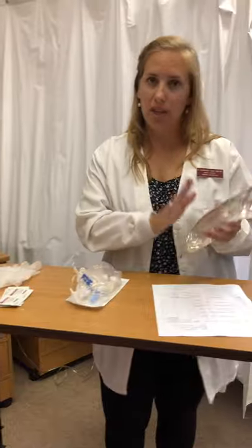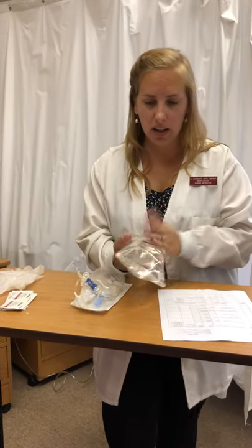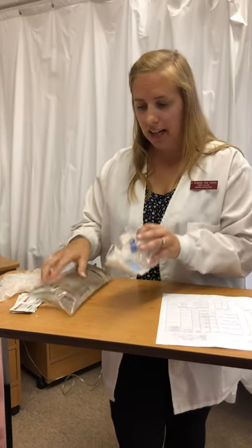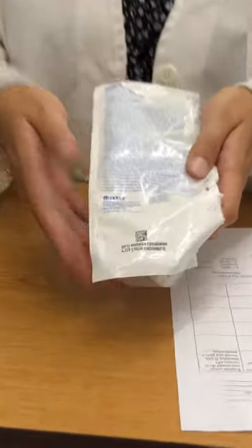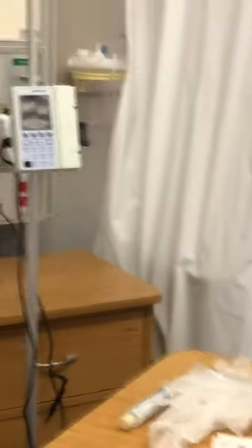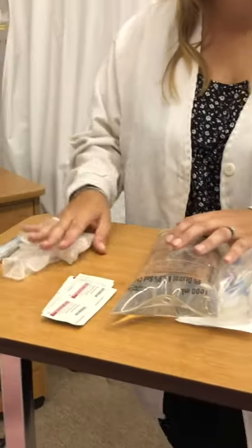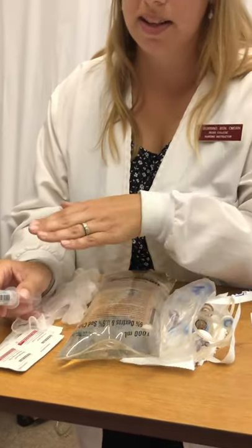I've checked my order and I make sure I have the correct fluid — that it's not expired, not leaking, not cloudy, and hasn't been tampered with. And then I have my tubing — specifically the Baxter tubing that goes with the Baxter pump. I also have some alcohol swabs, gloves because I'm handling technically a medication, and a normal saline flush because we always flush the IV before and after to keep it patent.